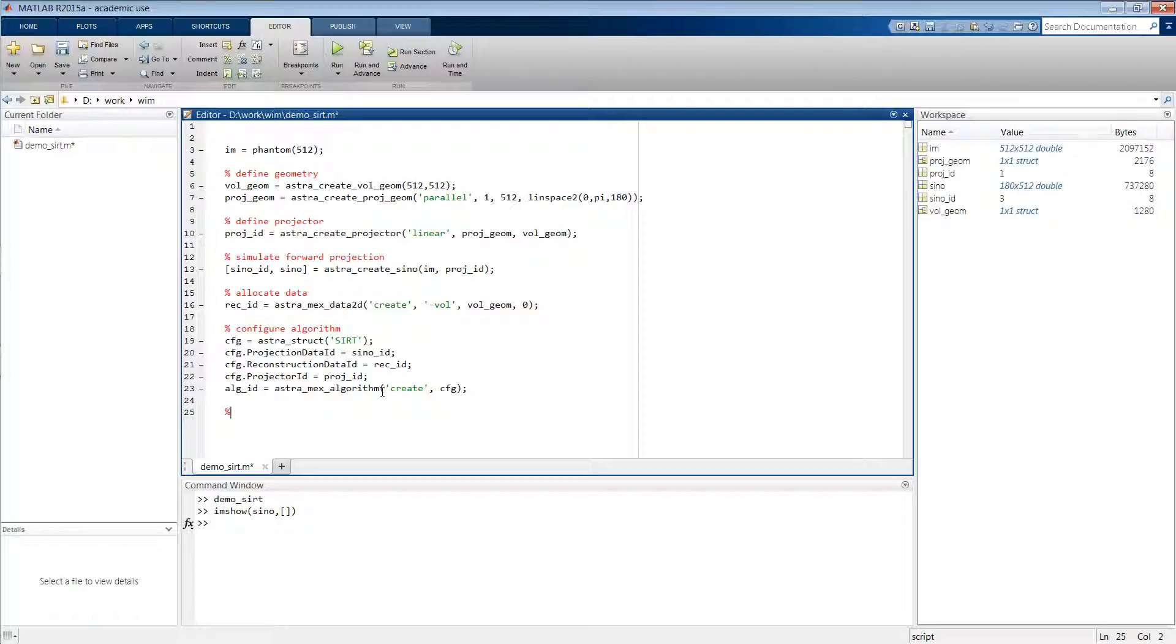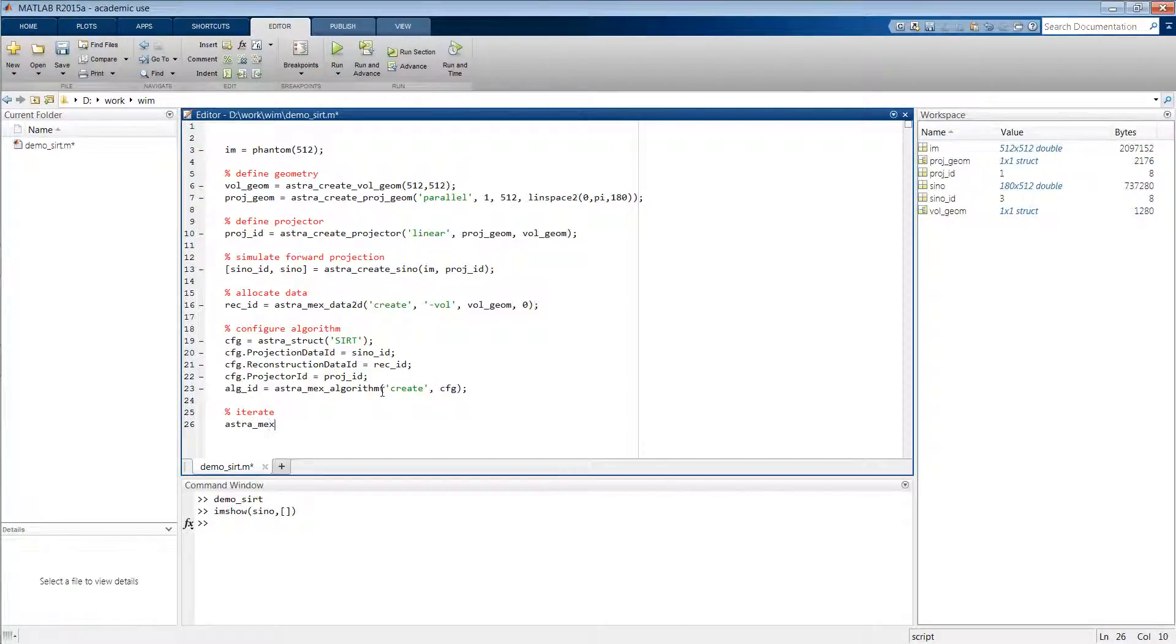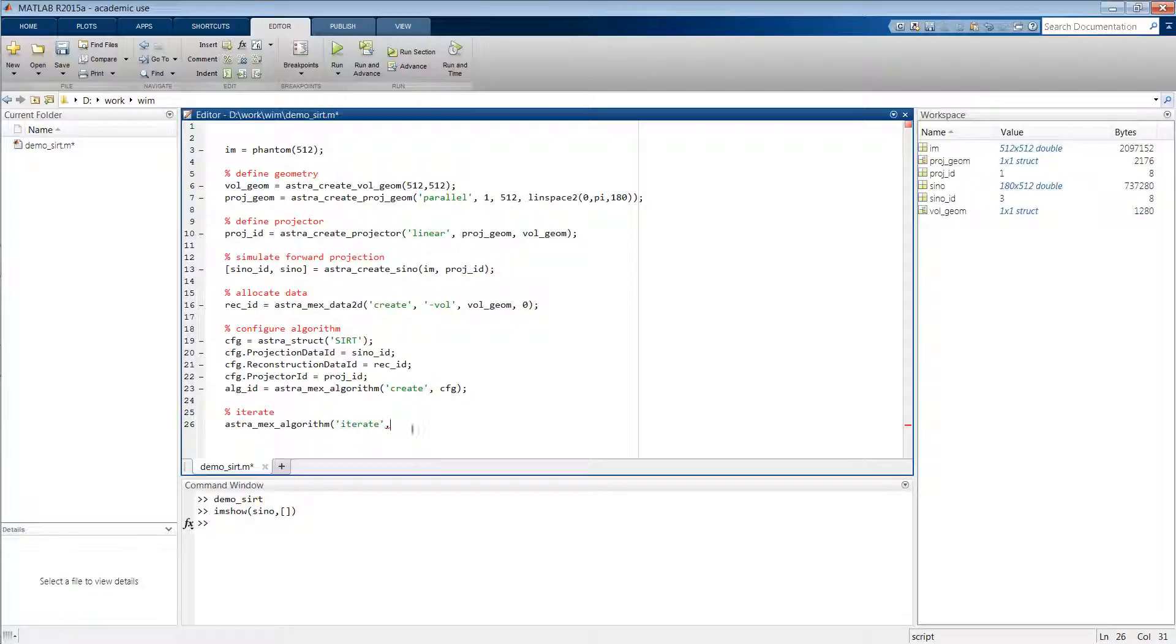Now with this done we can start the iterative process, which we do by the function astra_mex_algorithm('iterate'), the identifier of the algorithm that we've just configured. And then let's say we want to do this for 50 iterations.